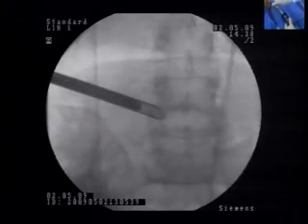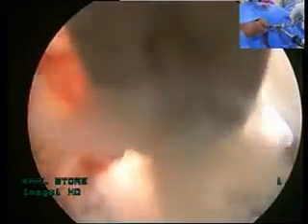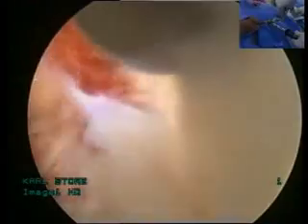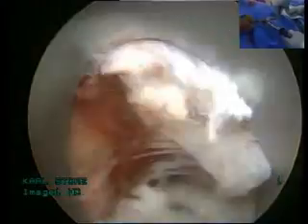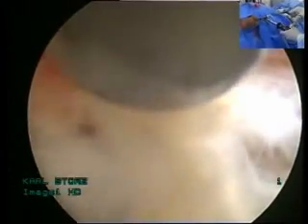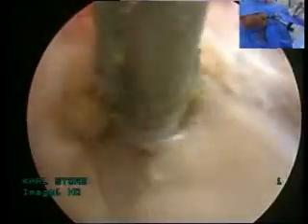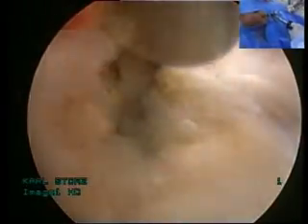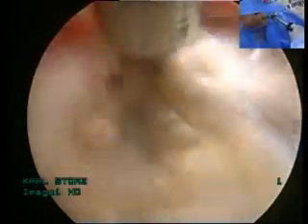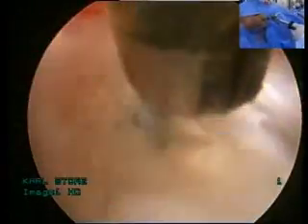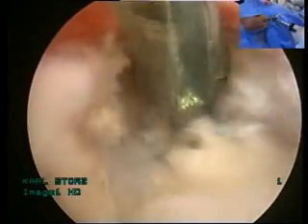The cannula is now in a more extradiscal position. We can see the epidural tissue around 12 o'clock with epidural fat and a little ooze. On the left side at 9 o'clock is the exiting root, which is L4 in this patient. The fragment is gently pulled outside with due care taken of surrounding tissue. Bipolar cautery is used to reduce the volume of surrounding tissue and to induce hemostasis.